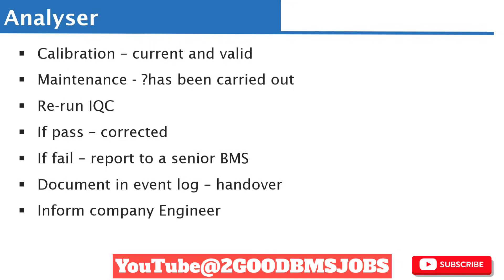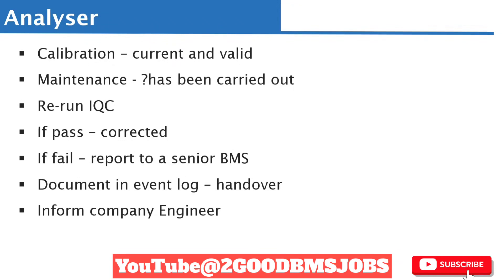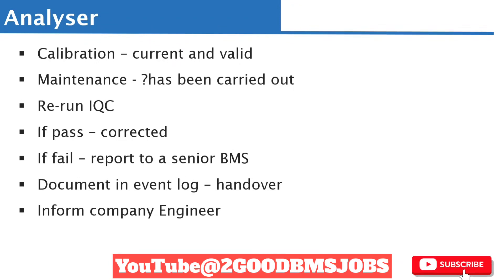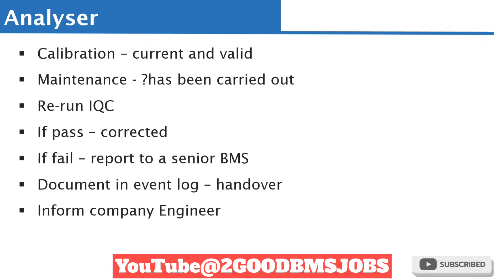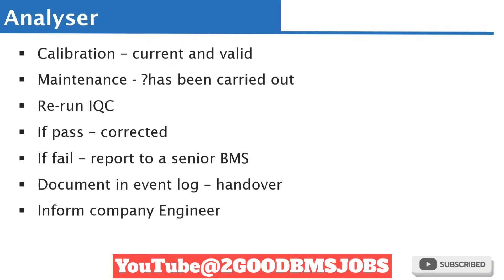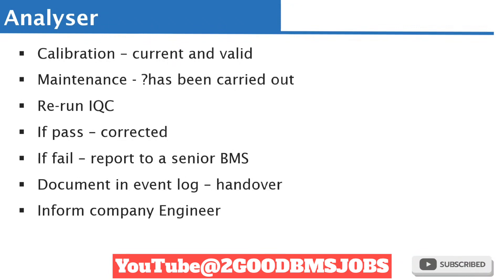After performing maintenance and calibration, you then rerun your internal quality control sample. If it passes, that means you have corrected the problem — meaning the issue was not from the quality control sample or reagent in your previous investigation. If it fell again, you may then need to report it to a senior biomedical scientist.